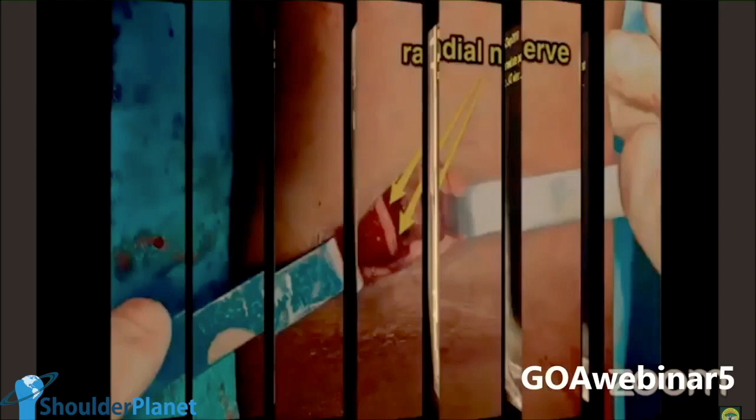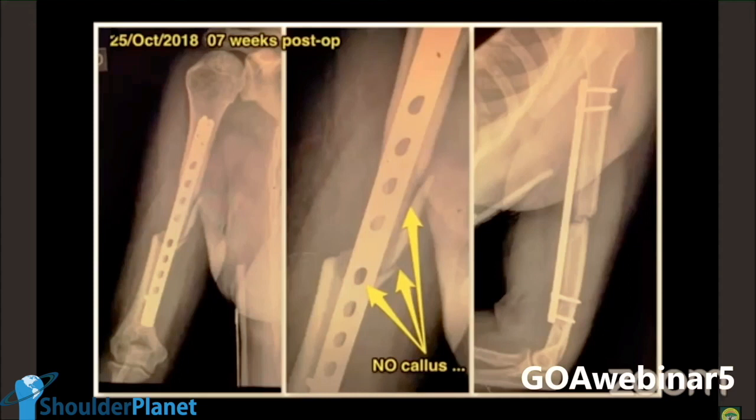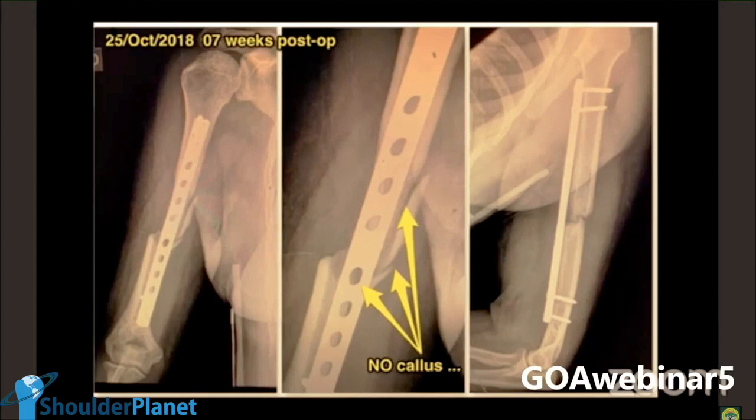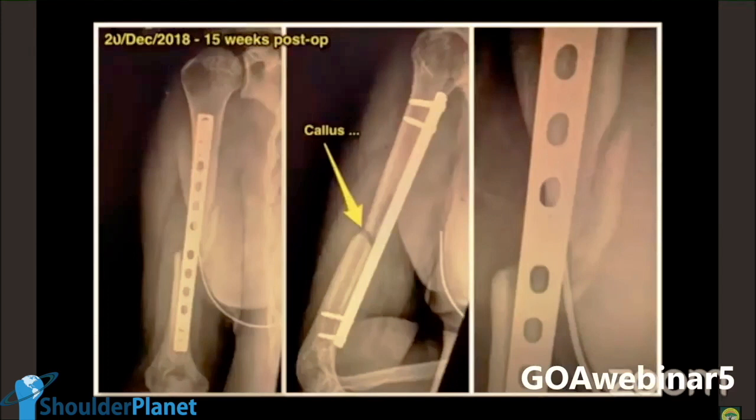And this is 2 weeks post-op. And this is 7 weeks in which you have nothing. In my practice, with older patients, it takes much more time to have radiographical healing. But clinical healing comes much, much faster. So this is almost a 70-year-old lady. I see basically no callus here. And I started to see callus at 15 weeks, which is not against the literature because radiographical callus comes on average at 12 to 16. But if you see the image on the right, I see nothing.